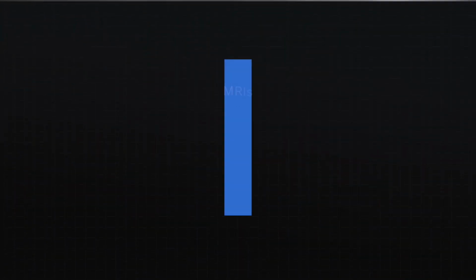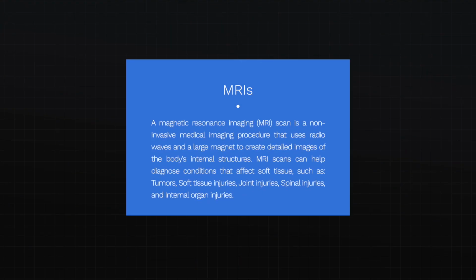MRI is one a lot of y'all have heard about, of course. MRI is what shows the soft tissue, right? So again, going back to the knee example, let's say a young athlete injures their knee. I'm worried about an ACL tear, okay? Now, the MRI is gonna be what we use to diagnose that. Outside of my physical exam, I'll feel the knee, I'll feel if it feels stable, but the MRI gives me the picture to look at the ACL itself.